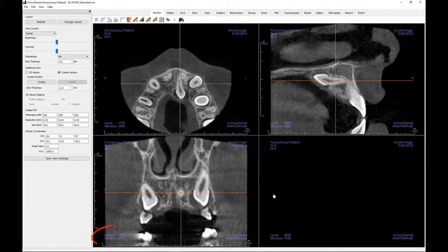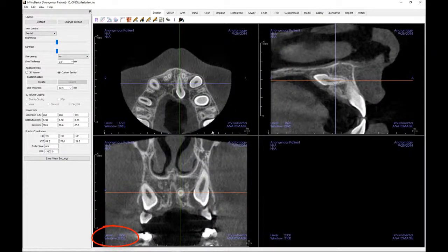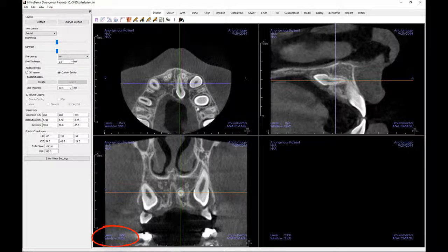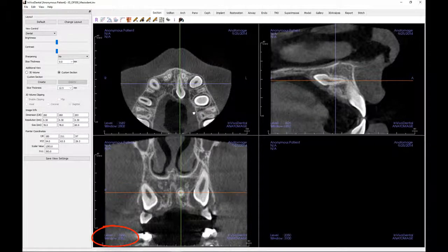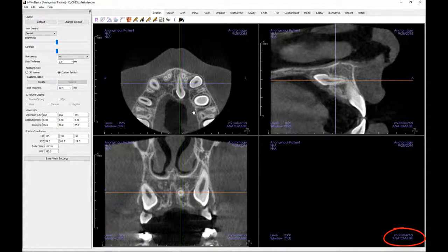Here you may anonymize the patient information, if desired, for display and printing purposes. The level and window located at the bottom left will change depending upon the brightness and contrast of the rendered image. These numbers represent Hounsfield units of density. In Vivo Dental and Anatomage, the developer of the software, is located at the bottom right and will not change and cannot be removed.